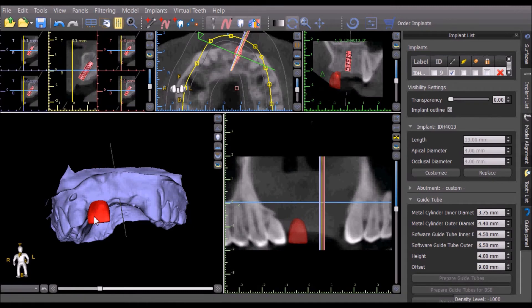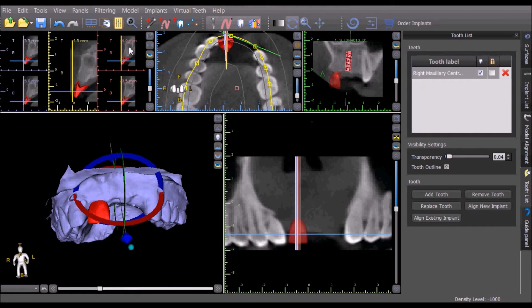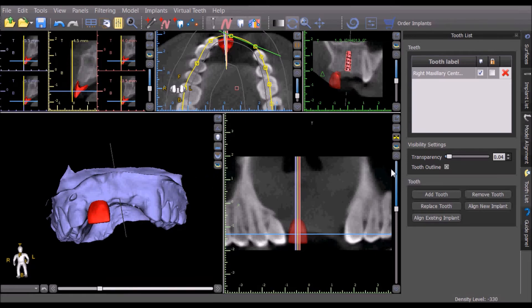Double clicking on a virtual tooth will center the implant in all the views and activate the tooth panel. Once you are satisfied with the placement, you can add a new implant to support the virtual tooth.